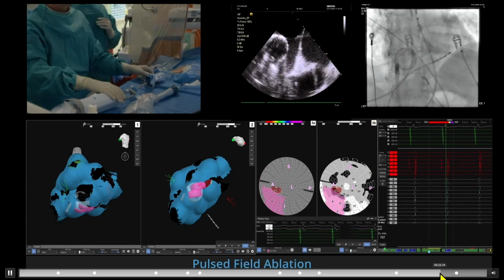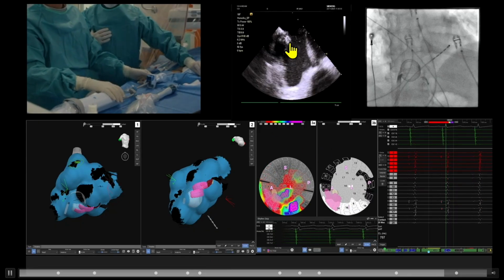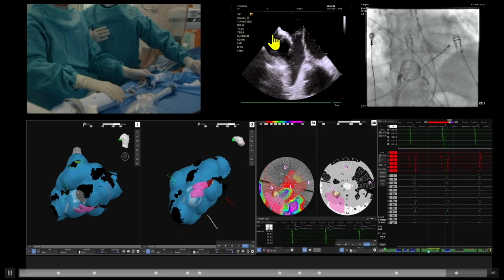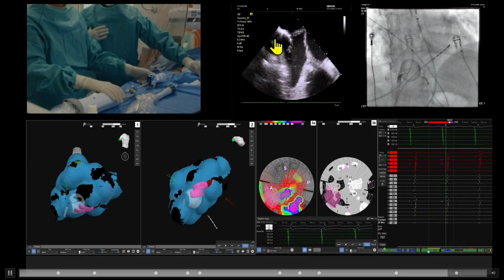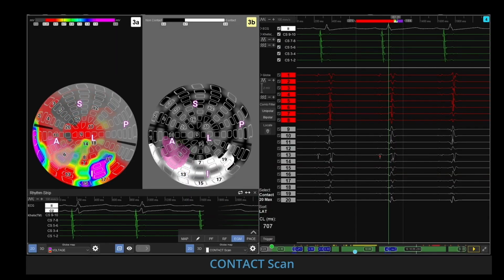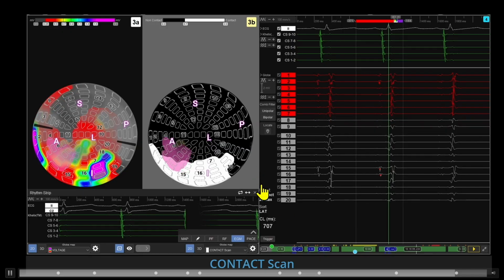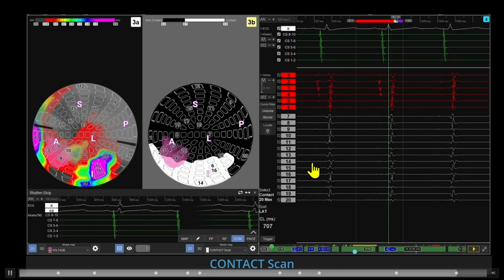Sorry, let me just see here. Oh, we're delivering the last PF. Okay, that's what it was, yeah. So we pull back here all the way to the IVC edge that you see here. And one nice thing is that because you have electrodes everywhere, as you pull back, you can ablate on the electrodes on the back end, for example. And then we're going to do, what is this, another contact scan.